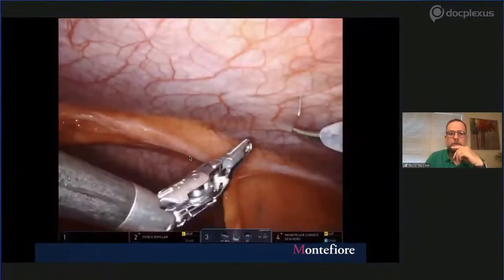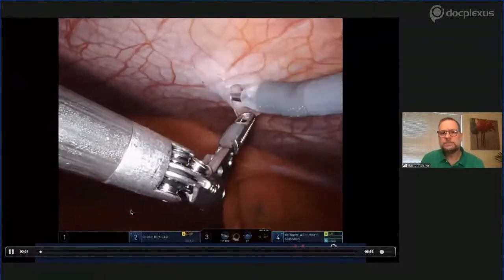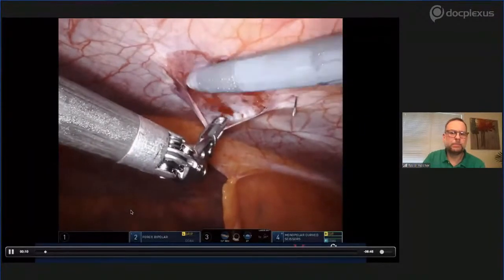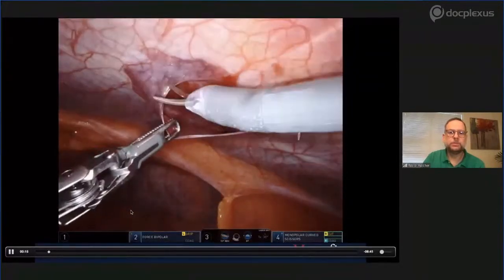So this is my own video. This is minimally edited. I put this needle at 5 centimeters from the midline just to locate myself, to see what is a good place to overlap the mesh. This is not a perfect spot to start, but you can see that even with thin peritoneum, you can start.